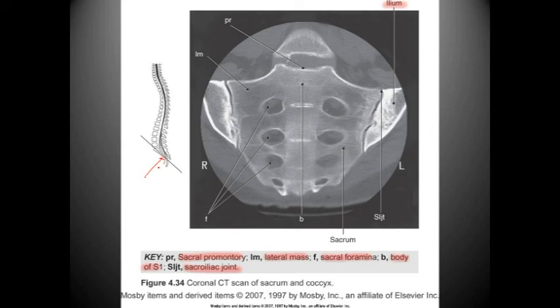I've shot some good sacrum and coccyx, and I've shot several bad, just simply because you're obscured by the patient anatomy, whether it's the patient is too large or the patient has a lot of fecal material, and there's no way that you can actually go in there and shoot this and get a good image.